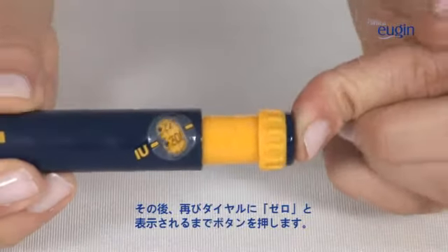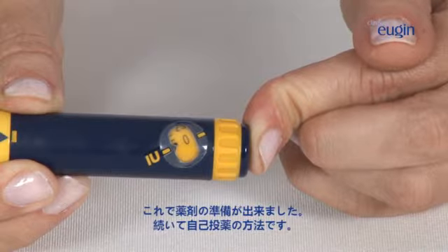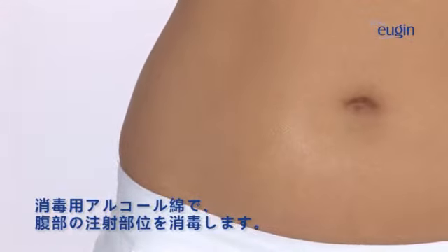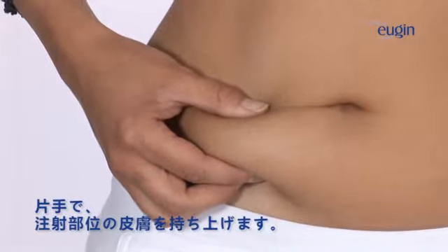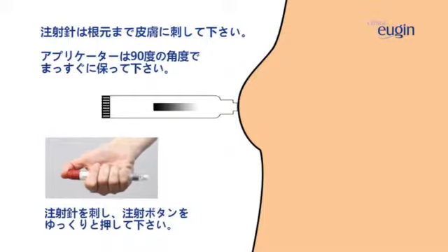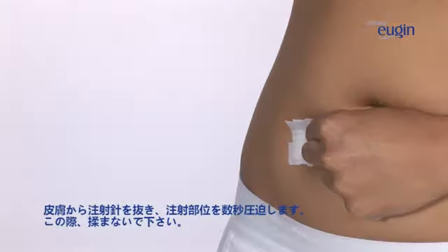Then, push the button until the dial goes back to zero. Now, self-administer the medication with the adjusted dose. Use a disinfected wipe to thoroughly clean the abdominal area. Gently pinch your abdomen with one hand to show up a wider area of skin. Insert the needle and gently press the injection button. Remove the needle smoothly and press on the zone for a couple of seconds without making any movement.